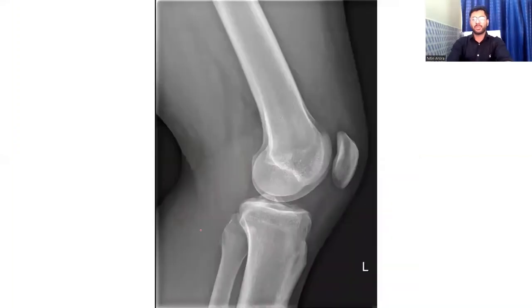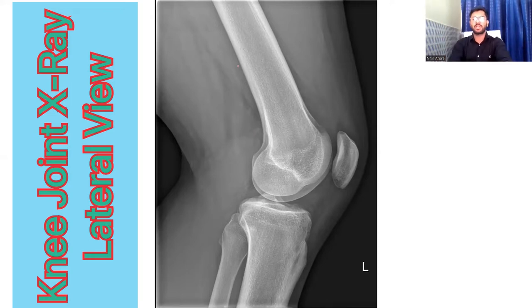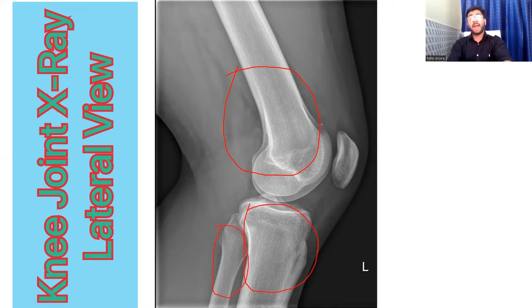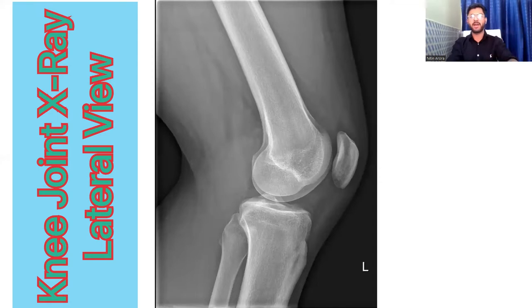Now let's move to the next view — that is the lateral view of the knee joint. When you have a lateral view, you can again see the same bones. Here is the femur, here is the tibia, here is the fibula, and last but not the least, here is the patella. So on this lateral x-ray, you can see all four bones: fibula, femur, patella and tibia.